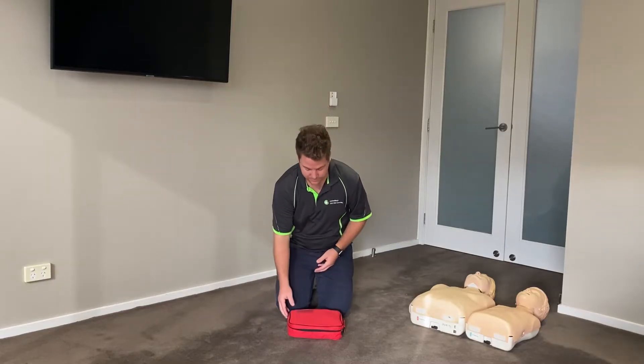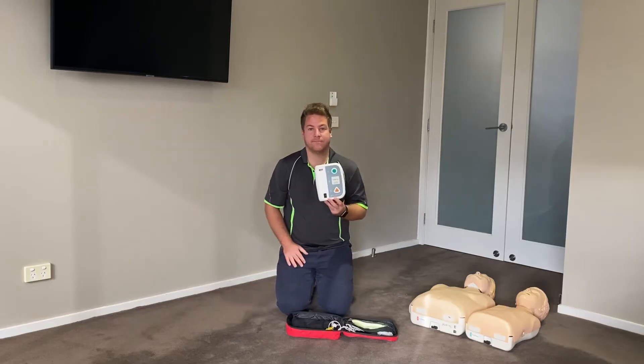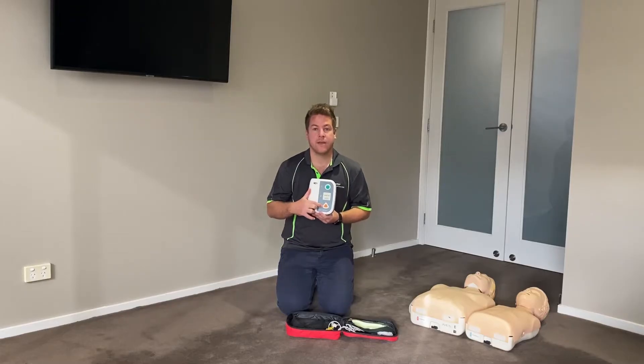I'm now going to demonstrate the contents of a defibrillator kit. In your kit you will have a defibrillator. There is a green button to turn on and off, and an orange button to deliver the shock. It is important to note that not all defib machines will have a button to shock — some will automatically shock the patient.